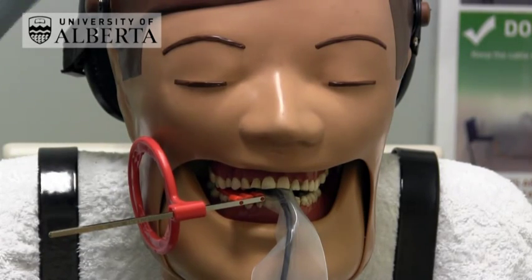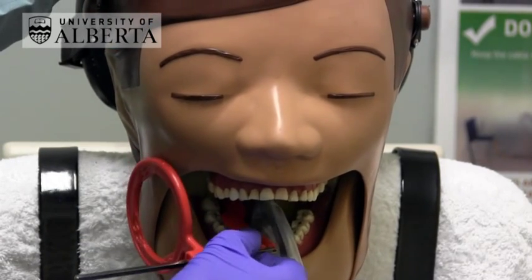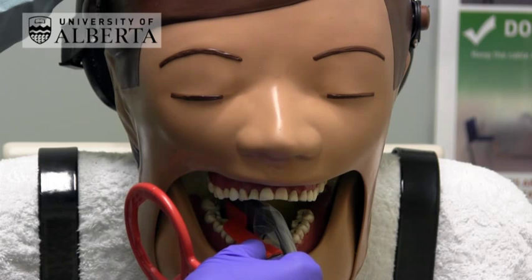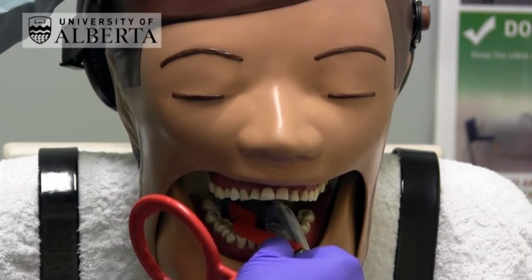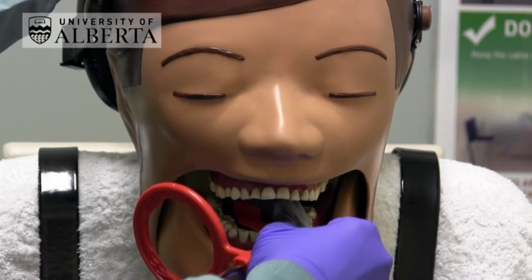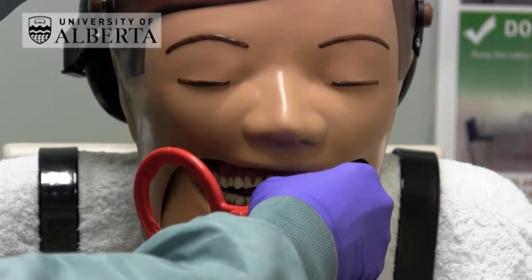When doing a premolar bitewing, the sensor is moved as far forward as possible. Then, in order to get the 3-4 contact, the receptor is angled towards the opposite arch. Ask the patient to close gently together.